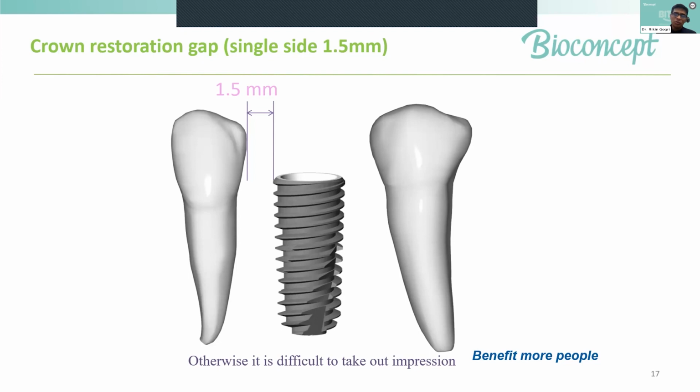also ensures that the occlusal loads are dissipated in such a way that there is minimum crestal bone loss. If the bone type is thin or you have very less bone, then the chances of crestal bone loss or vertical defect increases. So this is how you try to plan and decide what implant size you would go with.